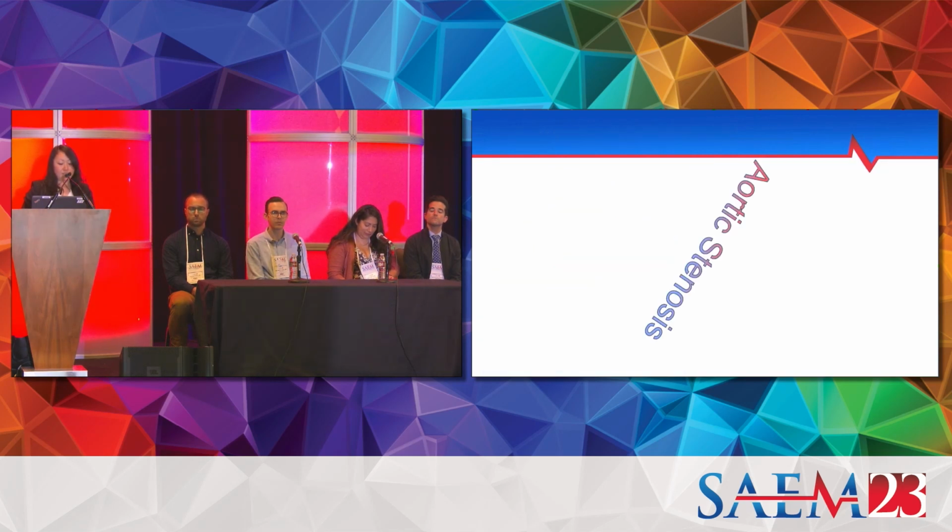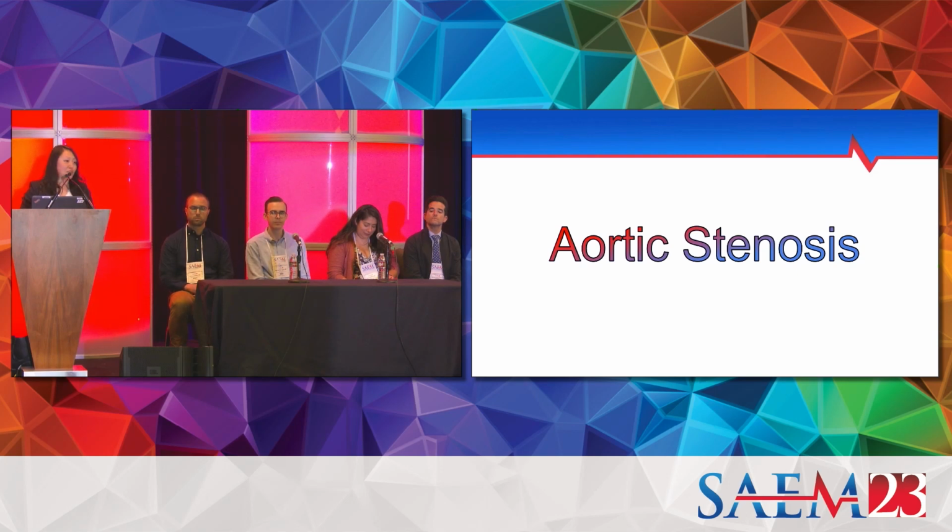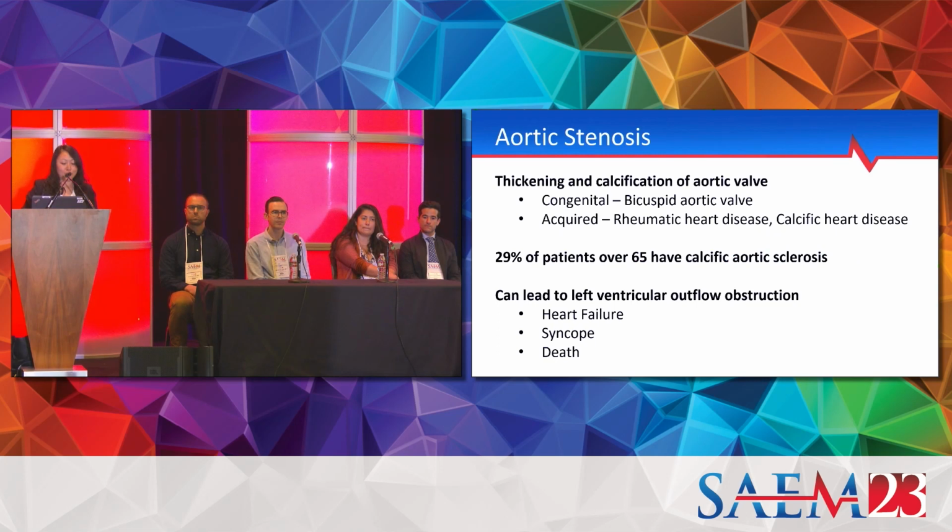And then finally, we're going to talk about aortic stenosis. This is one that we see all the time in the emergency department. How many old people who syncopized and fell do you put in your obs unit to get an echo and see what happens to them over the next 24 hours? Sometimes if you can get a little bit of early information about whether or not they might have symptomatic aortic stenosis, you can expedite them getting on the track for a valve replacement or potentially getting more of a cardiology workup instead of being in limbo.